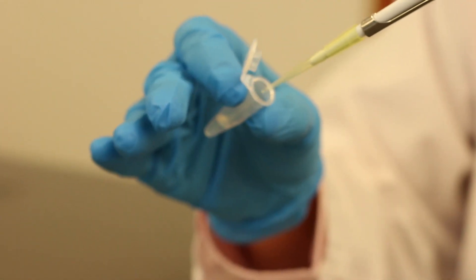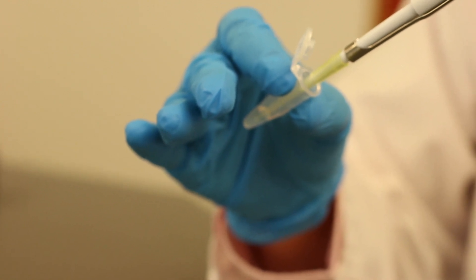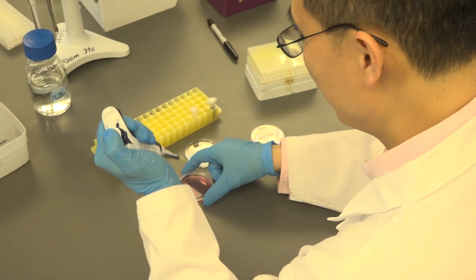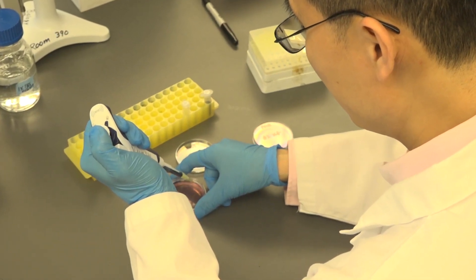After pipetting up the NGF solution, check to make sure there's a liquid in your tip, as you will pipette a very small volume. When adding solutions into the culture dish, pipette against the inner wall of the dish.